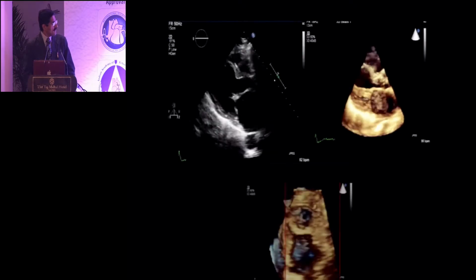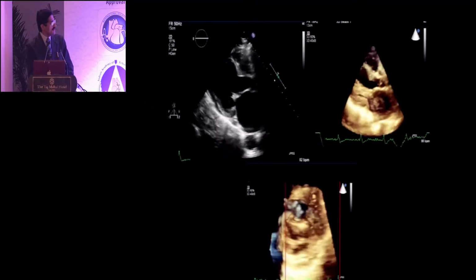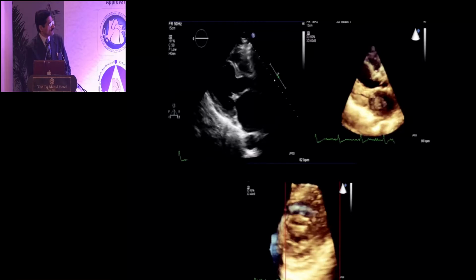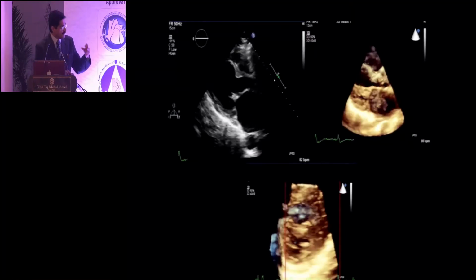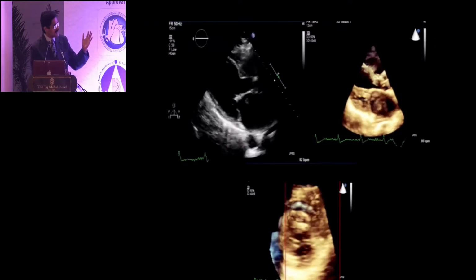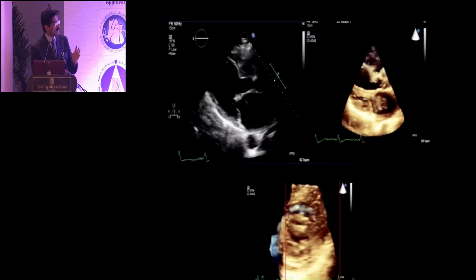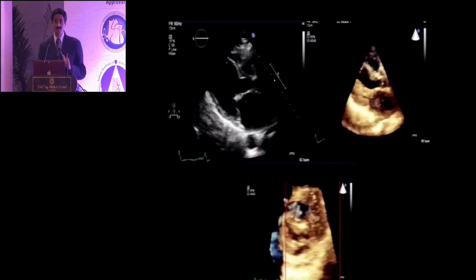Now in this case, this is today's morning case by itself, where we found this patient with a significantly involved proximal cord. On 3D examination, if you have the proximal cord fused and involved, see, the cord fusion starts from the papillary muscle and they just migrate towards the leaflets. So when the proximal cord is also involved with fusions and the length of the cords is significantly reduced, then we can say that in these patients, even cord separation is difficult.